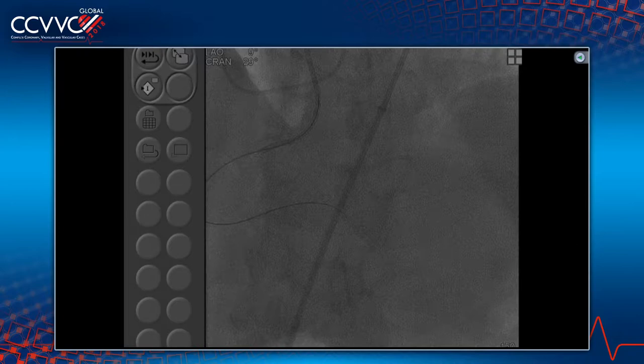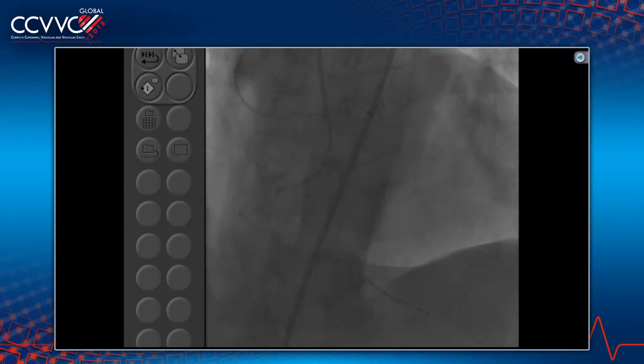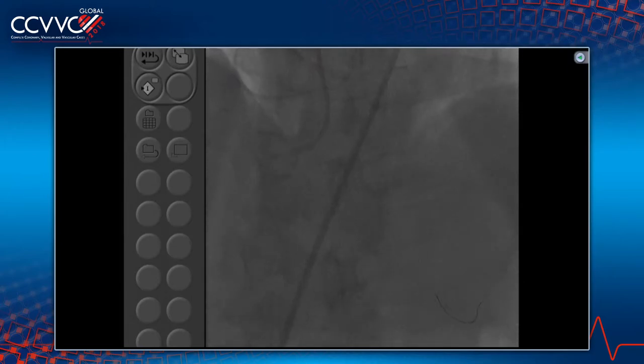I like aspirating to see whether there is blood. You already have a confirmation that you are across. I think with just a cross, just enough. Whenever there's a long occlusion, you also have enhanced friction through the occlusion for the catheter. So although it's crossing, there's also more resistance to get across with longer length. That's actually very good.